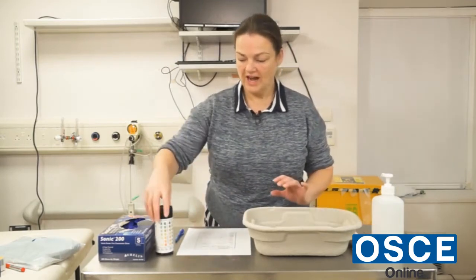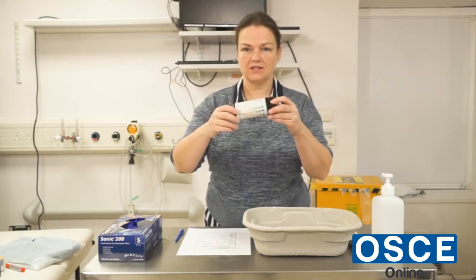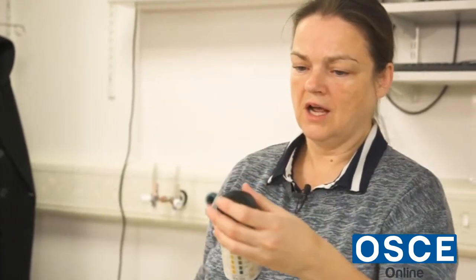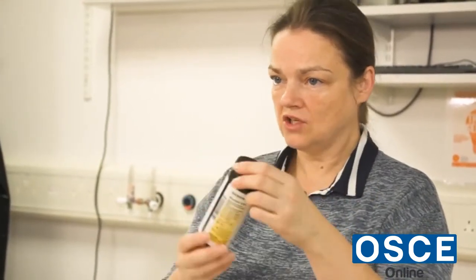I would just check that I have the urine dipsticks, which is one of these bottles. These are the ones they're using in the OSCE, and this is the form they're using to put the results on. And we would check that this had been kept in a dry, dark place, so it's been stored appropriately, that it's in date, so it's in date till 2021, and happy to use that.